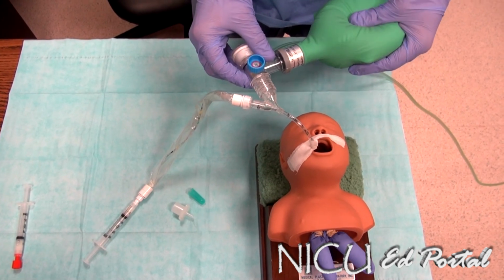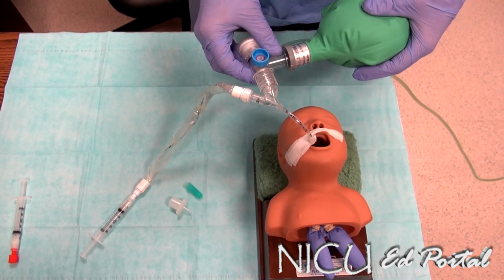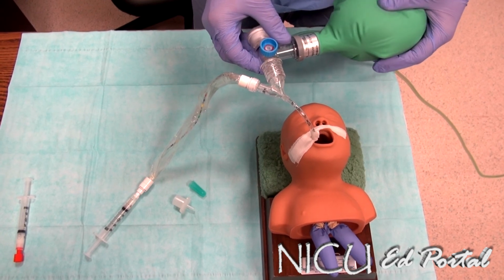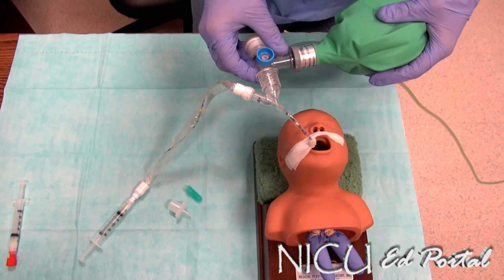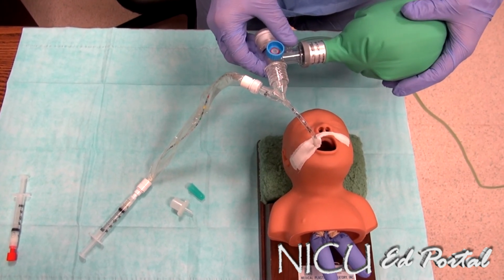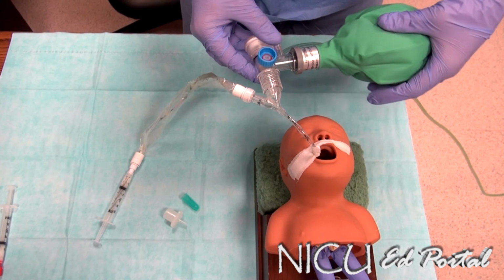So the next step is inserting the catheter to proper placement, administering the surfactant, and removing the catheter, making sure our patient is stable through the process. So here we have to properly measure the correct depth of the catheter in the ET tube and then administer the surfactant. For the purpose of the video, I will focus on inserting the catheter. You can pretend we are still manually ventilating the baby through the whole procedure.